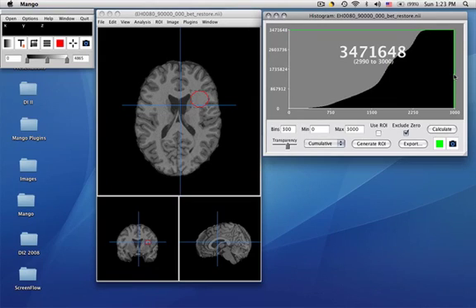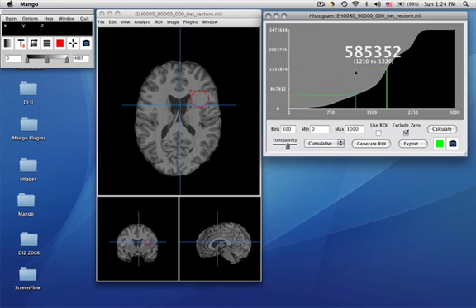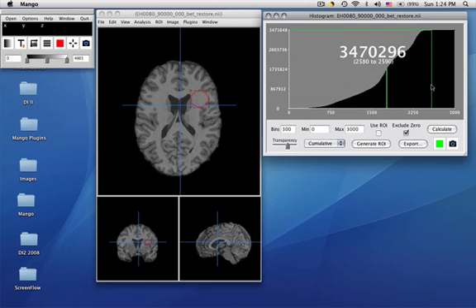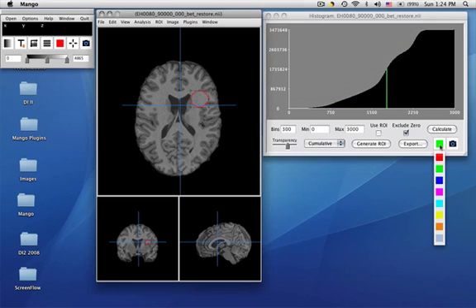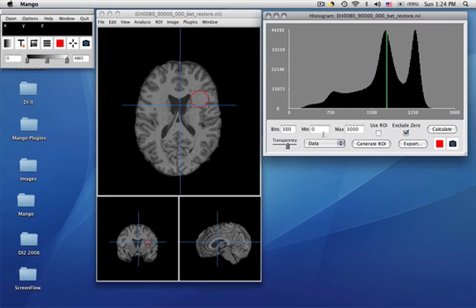So if you want to know the median, you come halfway down. This is the point where half the voxels are within the range of 0 to 3000. In this case, we see that number. So this is a nice way to look at median using a histogram. So let's go back to the data.